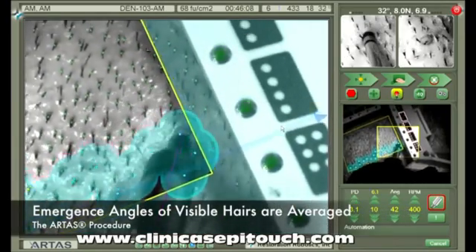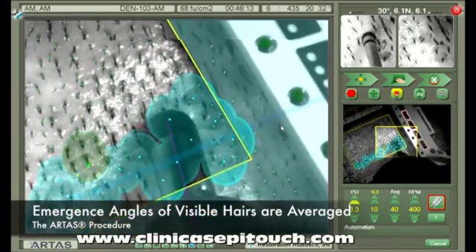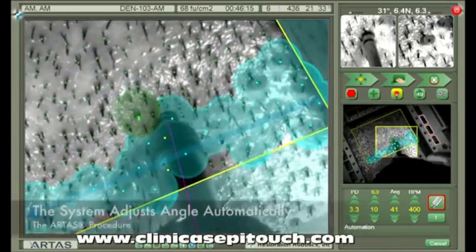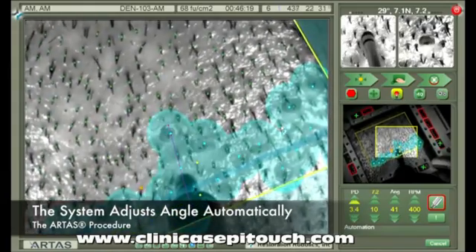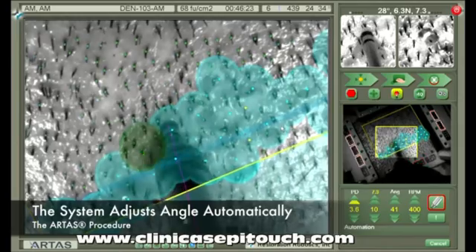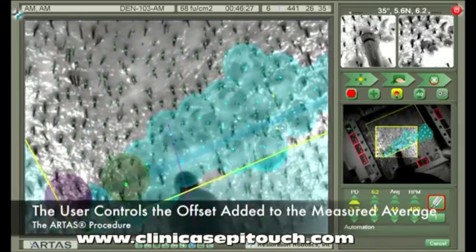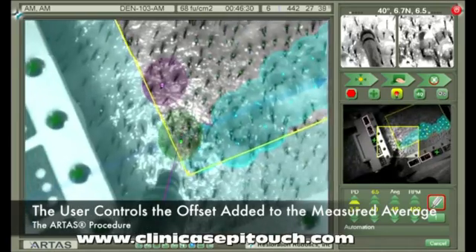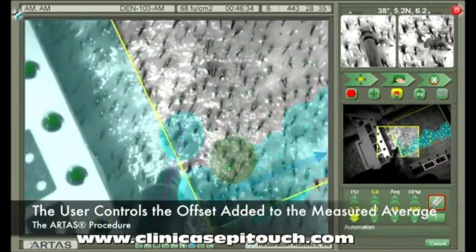The final automation parameter is the harvest angle. To begin, the emergence angles of all the visible hairs are averaged together, and the system automatically adjusts the harvest angle based on this information. The user simply controls the offset added to the measured average. The offset plus the measured average becomes the harvest angle.